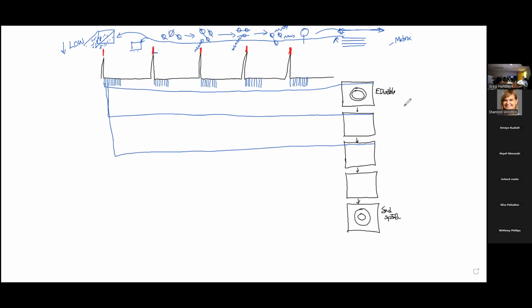And then right here, we've got the third point in time, and we come down here and we get another line. And then look at the next heartbeat. Well, what do we do? Same interval, short period in time after the QRS complex. We come over here. And look at that. It just goes very nicely how you're filling up these lines, filling up these frames of the movie. See how that works?